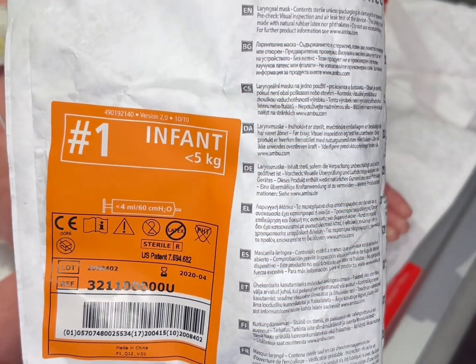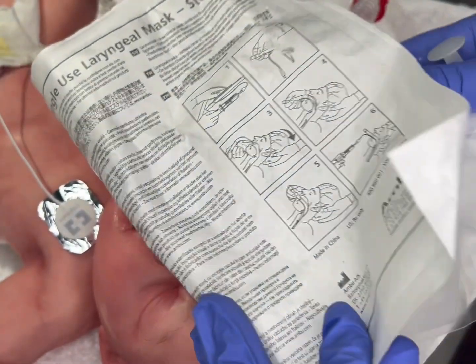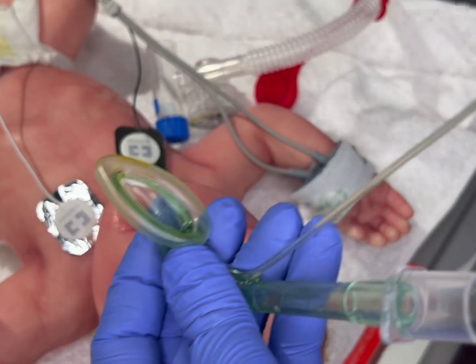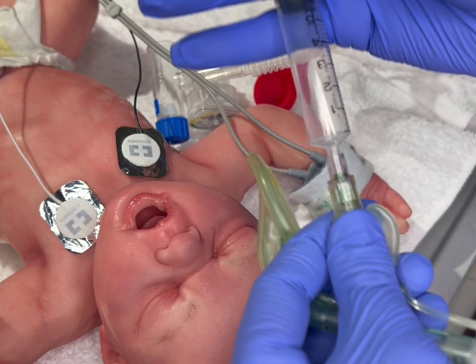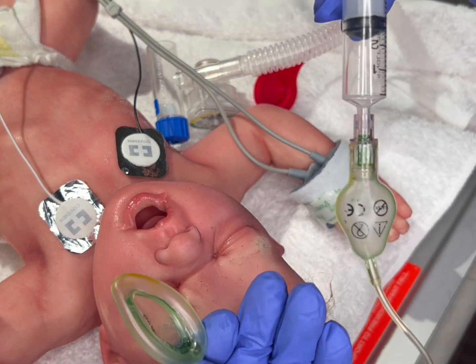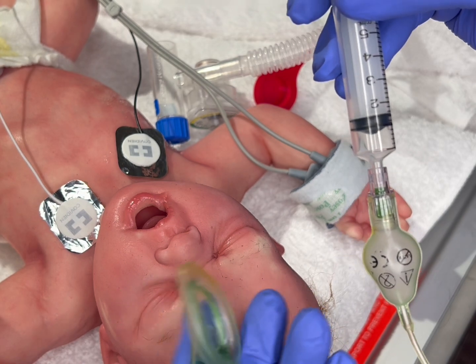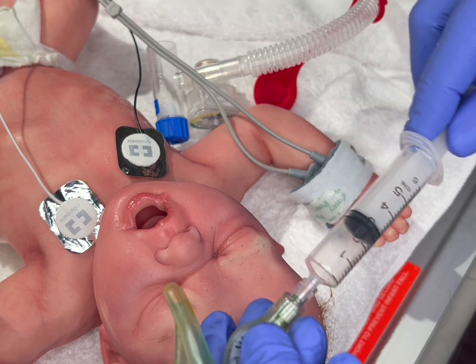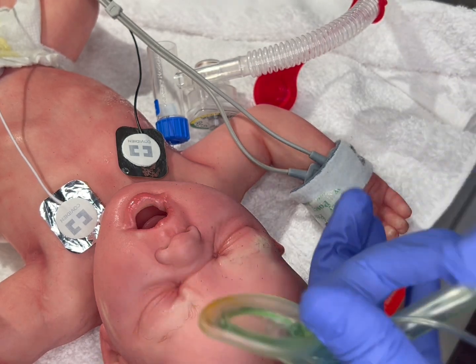Once you have chosen your LMA, you want to prep the patient and the equipment. You prep the patient by placing their head at the end of the bed as if you were endotracheally intubating. The LMA is prepped by attaching a syringe to the pilot balloon and adding approximately 4 mLs to the cuff and assuring its functionality. Just prior to placement, you will remove all the air from the cuff, deflating it completely.